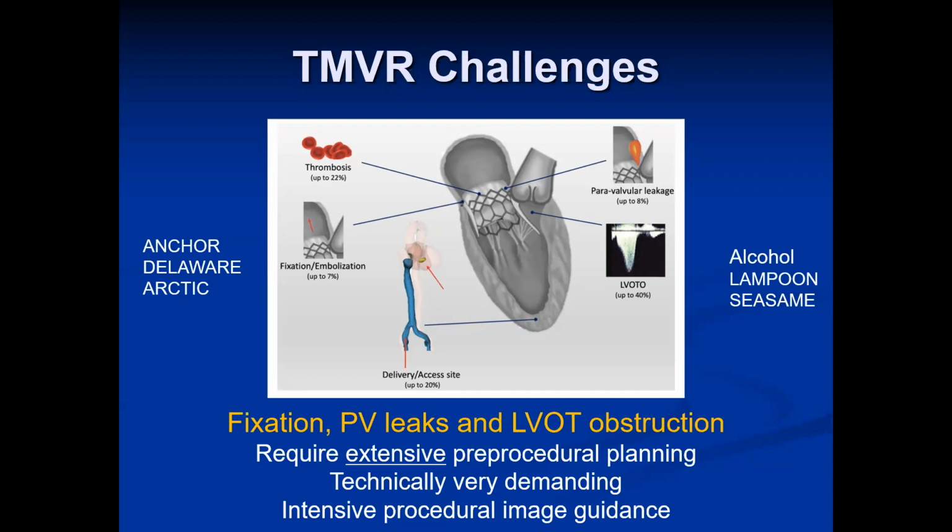Yeah, we see this rarely. If you look at the overall incidence, since we've treated close to 1,000 patients with clips at the University of Washington, the number of patients that go to the operating room after a failed clip is maybe a selection bias, I just don't know what the denominator is, less than 1%. If somebody was in cardiogenic shock, just like acute MI and a stent, and somebody put a clip in and you stabilize the patient, I think that's an amazing thing. And then we can deal with that later.